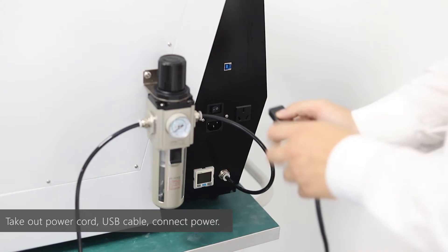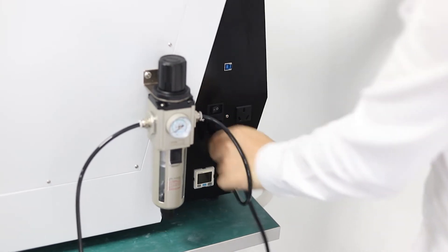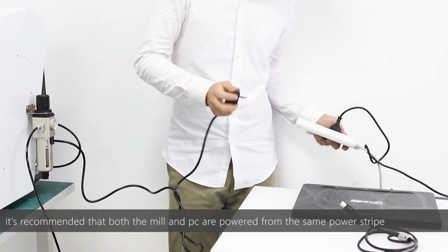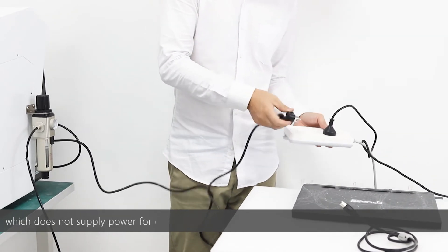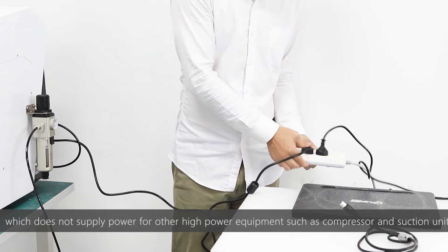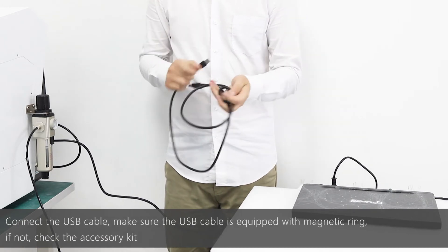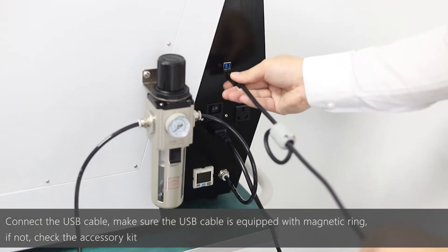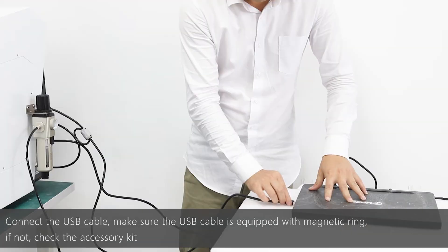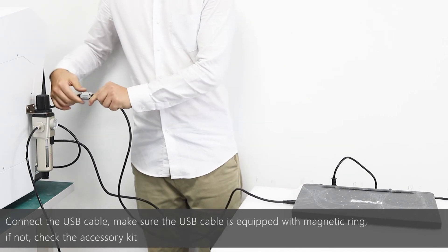Take out the power cord and USB cable. Connect the mill with power. It is recommended that both the mill and PC are powered from the same power strip, which does not supply power for other high-power equipment such as the air compressor and suction unit. Connect the USB cable and make sure it is equipped with a magnetic ring; if not, check the accessory kit. If a power transformer is equipped, connect the mill to it and then to the power.